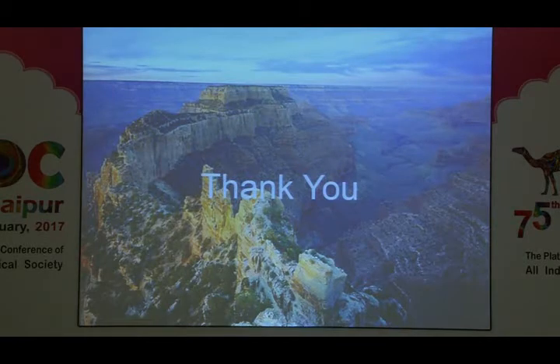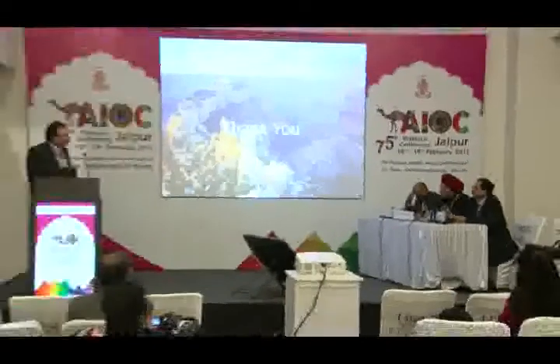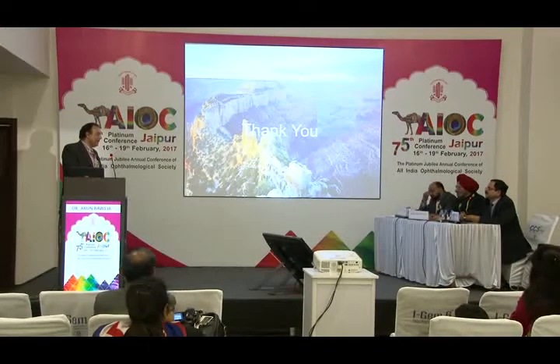What is this bubble pachymetry you were talking of? Bubble pachymetry is recommended as a procedure of measuring pachymetry on the femtosecond machine itself. I have not done it, but this is recommended in the literature. It measures the real-time pachymetry when you're doing the femto. It is supposed to be online while you're doing the procedure. You first create bubbles, then you have a pachymetry. When you're doing the bubbles, you come to know at what depth they are coming.